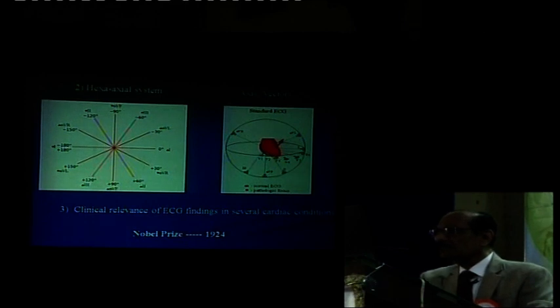One is AVR, which is looking at the heart through the right shoulder, through the right atrium. Another is AVL from the left shoulder. And third is 2, 3, AVF, which are looking at the inferior portion of the heart. And these are grouped together. This is forming one group. AVL with V5, V6 is forming another group. V3, V4 is forming another group. And V1, V2 are also forming another group. These are separate groups on the basis of which we make our ECG diagnosis.